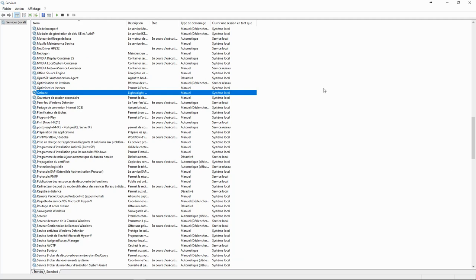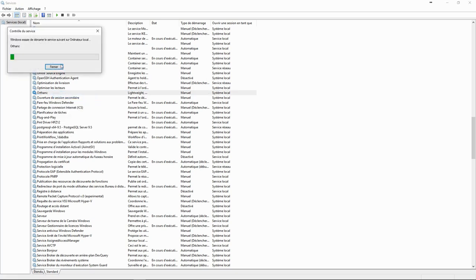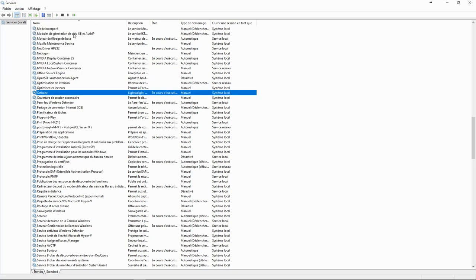Let's start Orthanc from the services panel in Windows. As a service, it doesn't start a graphical user interface or even a terminal. It runs in the background.